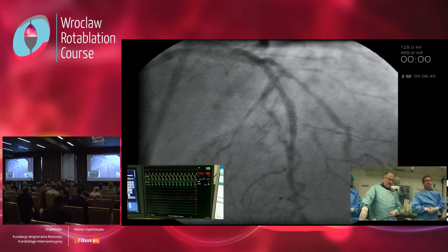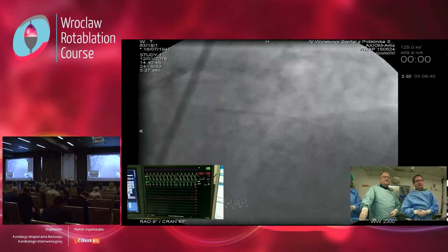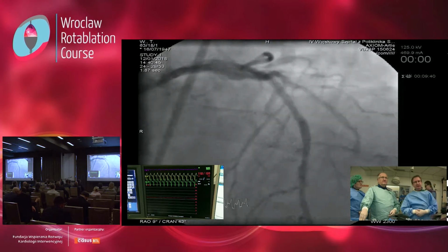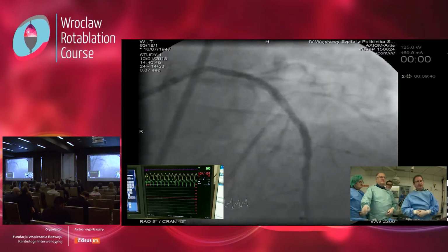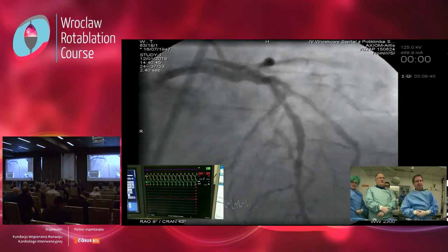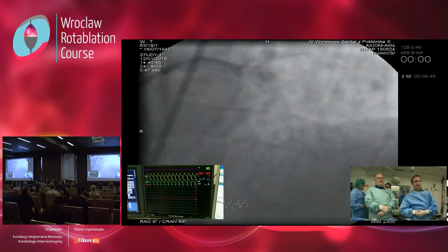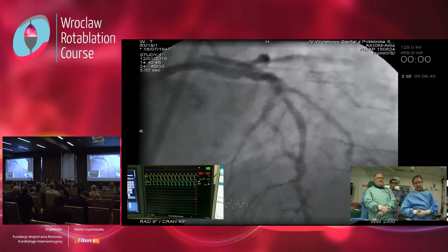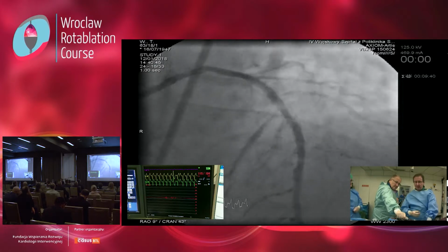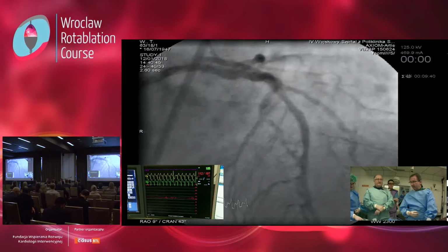There are two suggestions from the panelists. One is cutting balloon and the other is IVUS. I think a cutting balloon is very close to the left main. I would be a bit skeptical, to be honest. So we still see the denting in the proximal ostial LAD. There is a lot of material, and that's why. So you have to either go with a bigger balloon, high pressure NC, or a cutting balloon, or just check definitely.